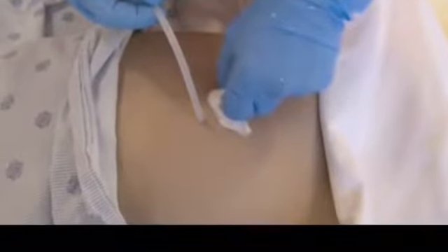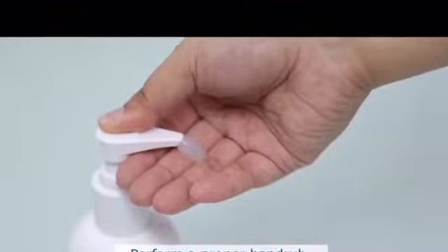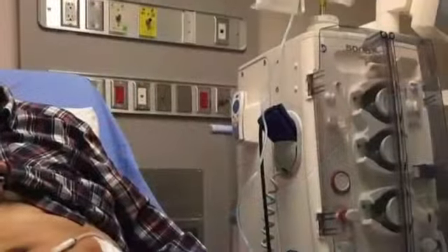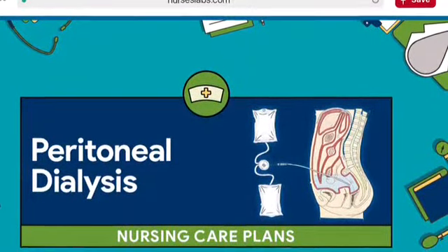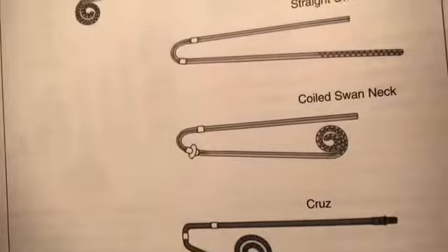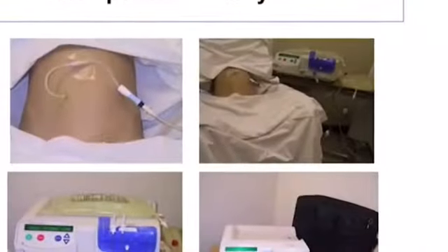So from the patient's point of view, in the peritoneal dialysis modality, the patient's experience and conditions are given important consideration. The patient will be presented with different modalities, catheters, comparisons, and the advantages and disadvantages of each modality and catheter, and the patient will have her own type of modality and catheter based on her personal choice according to her lifestyle, condition, and daily routine.